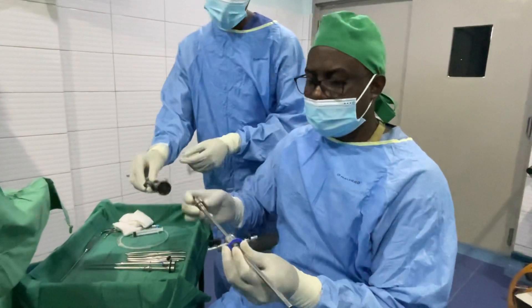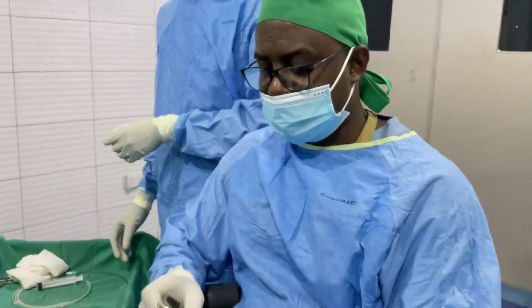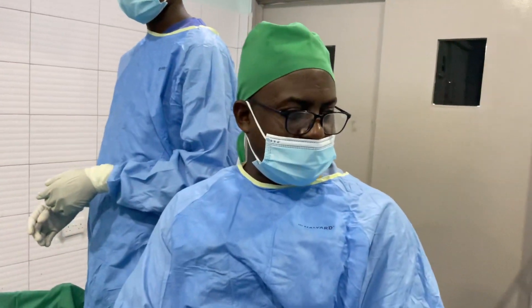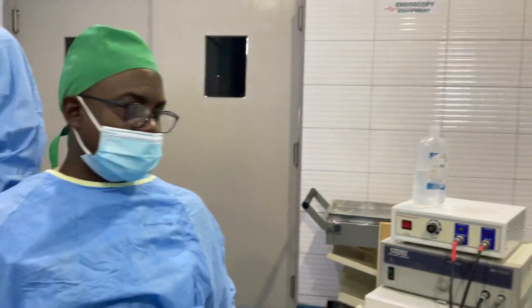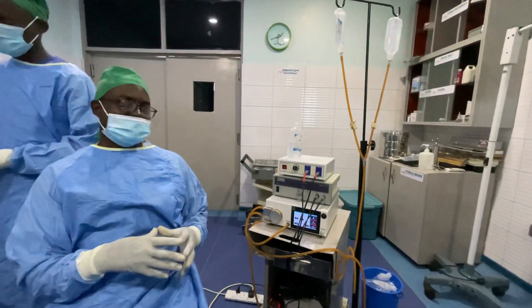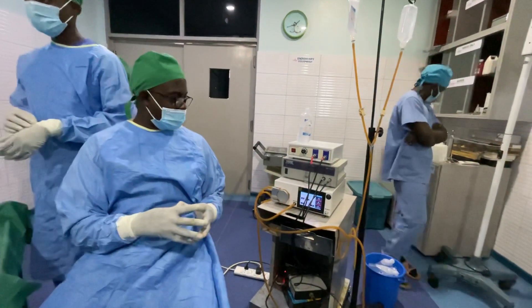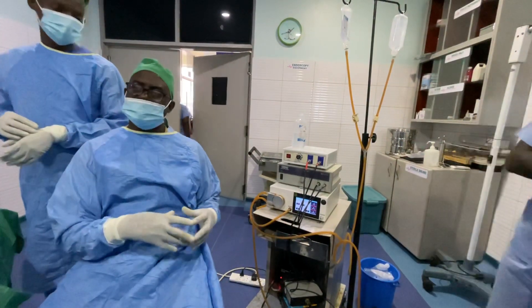You have to anticipate what you are going to do before you start hysteroscopy. You also need a fluid pump. The fluid pump helps you to distend the cavity of the uterus. The uterus is a muscle so you need to distend the cavity or else you only get a potential working space. Most of the time we distend the uterus using the pump.